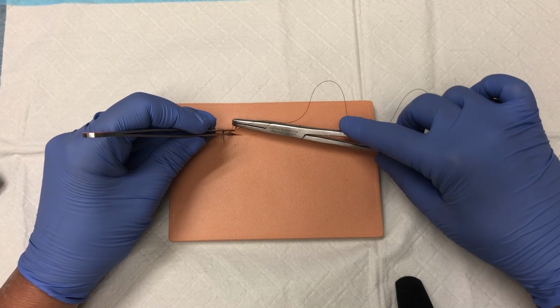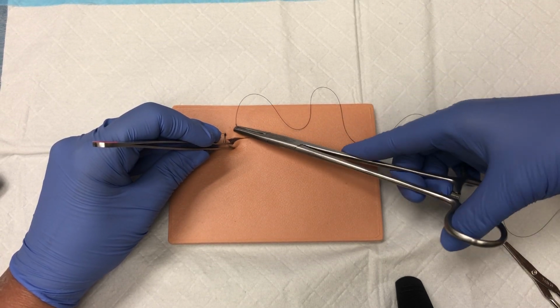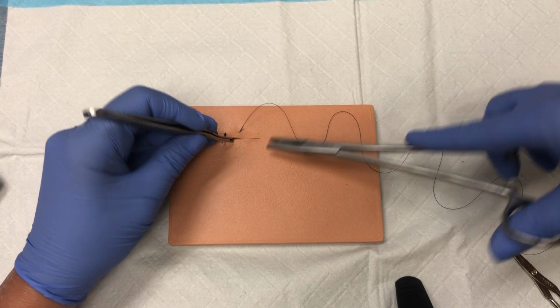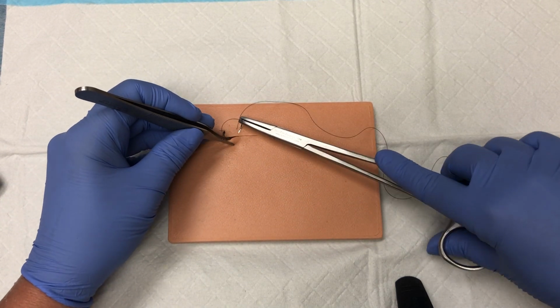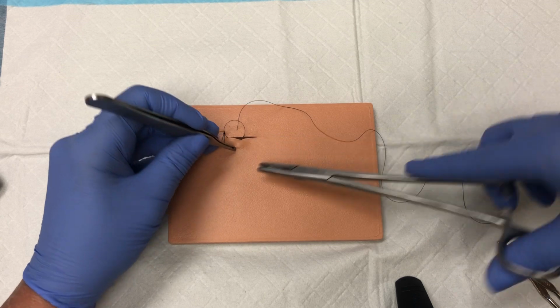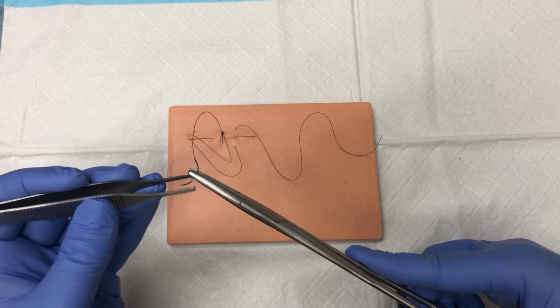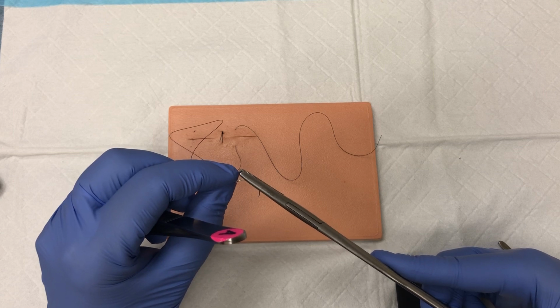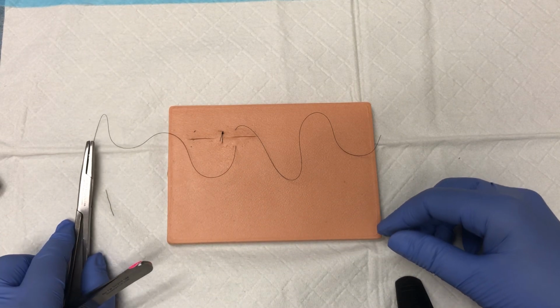If you would like to certainly do a hand tie, you can do so. And you can certainly choose to do either a one-handed or a two-handed tie. Appreciating that a one-handed tie allows for the needle to remain essentially immobile. So if you're going to do that, it's often commonplace, especially in the operating room, to grasp the needle, again, not at the tip, but grasp it along the curve of the needle and set it to the side.